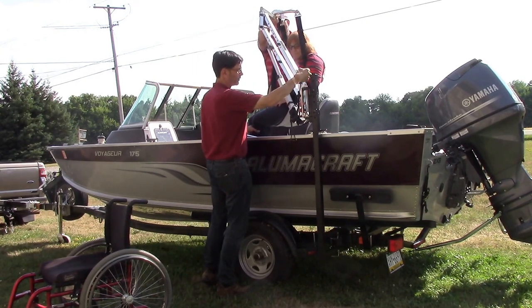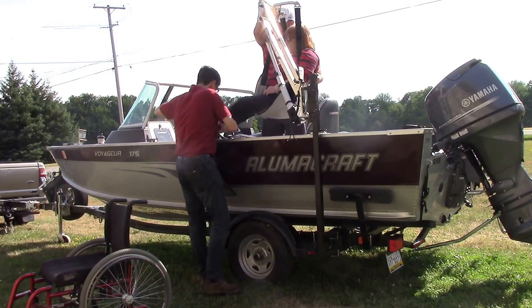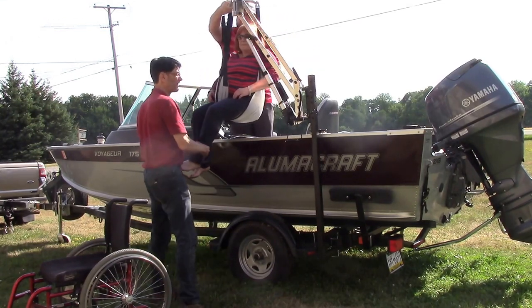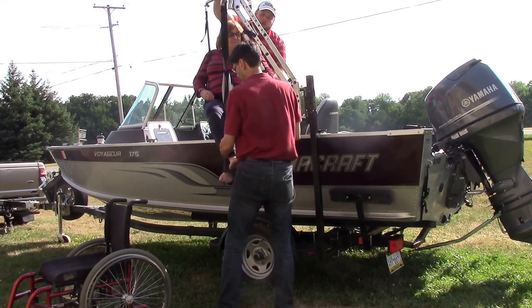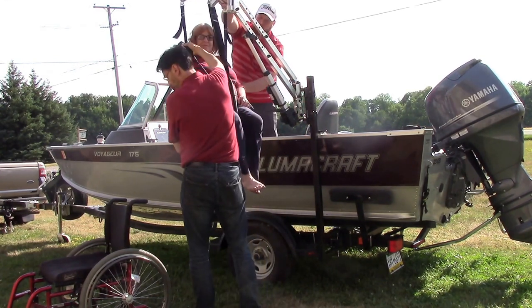You've got some handy Velcro here. I'll just put the adapter right there, bring the legs over. At this point, we're going to put the wheelchair in place.